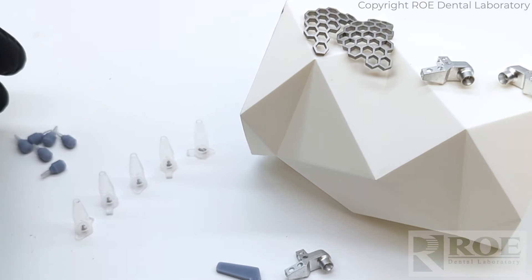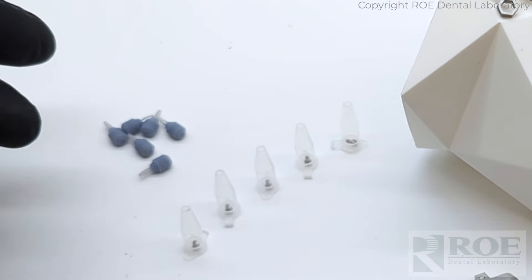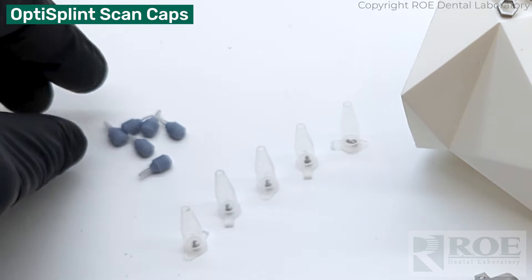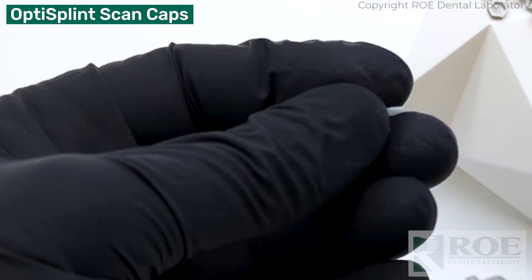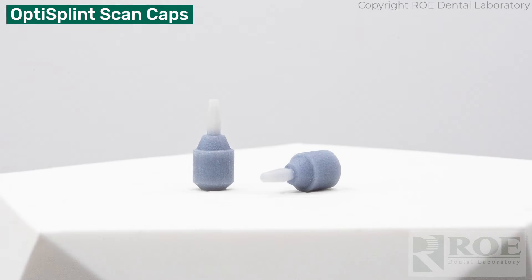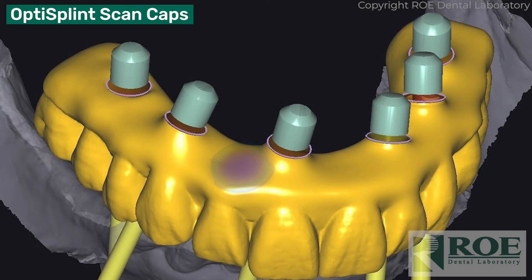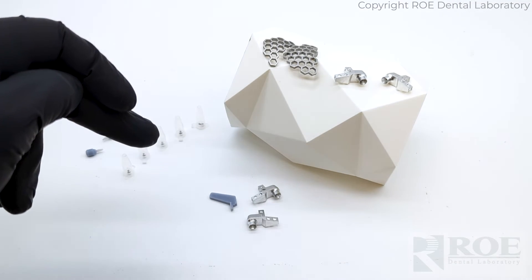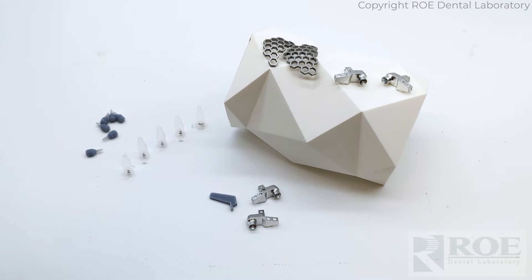Also included for the restorative component are prosthetic scan caps. If you've worked with Rho for a long time, you know these are similar to an iJIG scan body — they are placed inside the multi-unit temp cylinder from the intaglio. These are used to reference and register to an analog, or a virtual analog. So those are for the restorative component.